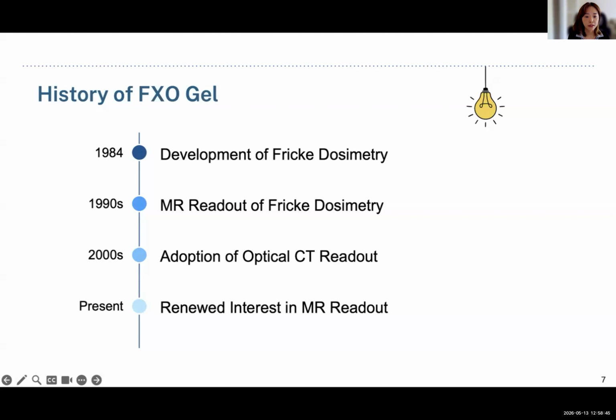However, unlike optical CT, where there is a well-established FXO gel formulation, MRI-optimized formulations remain much less established. So that serves as the main motivation behind my project.